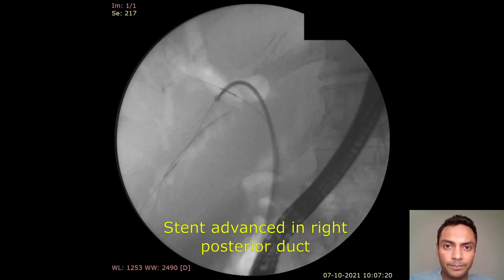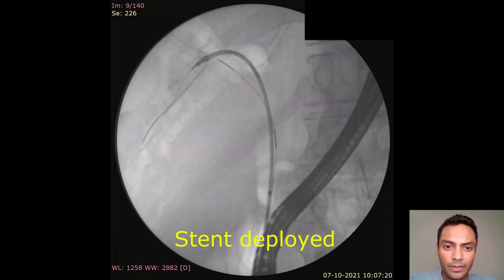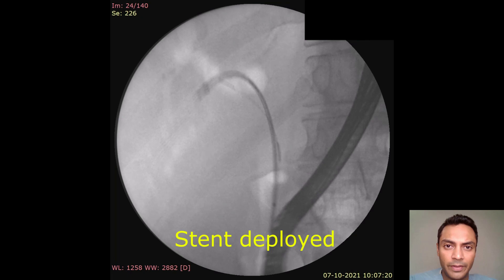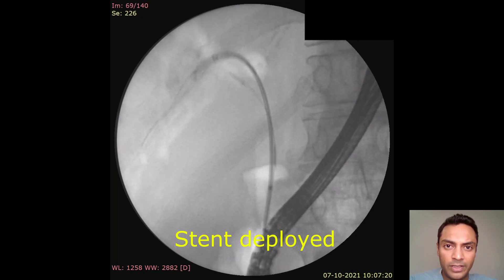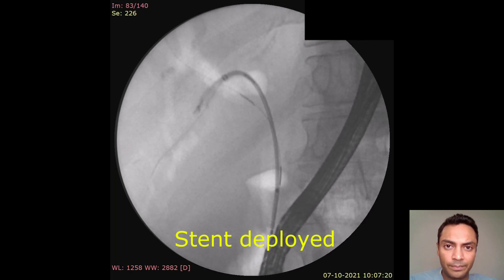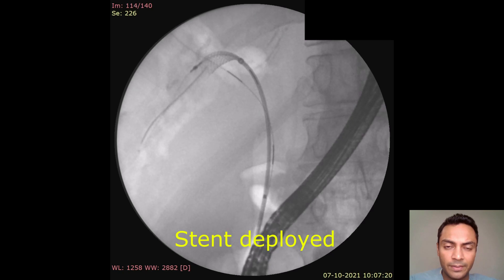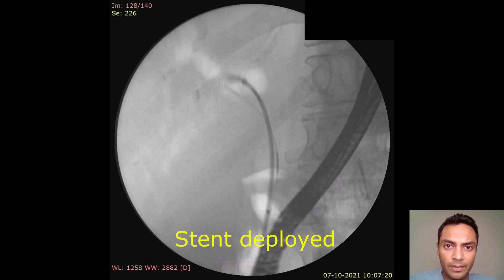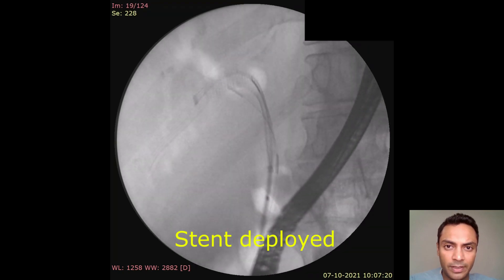Next, the right posterior stent was placed first. Here we are using a Wall stent by Boston Scientific, which is being placed in the right posterior duct.